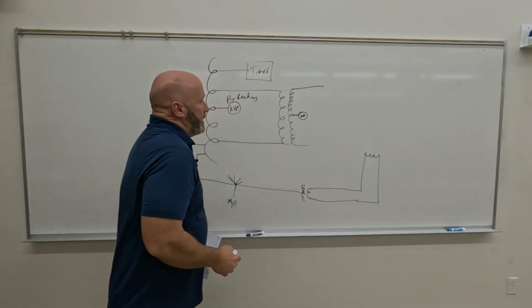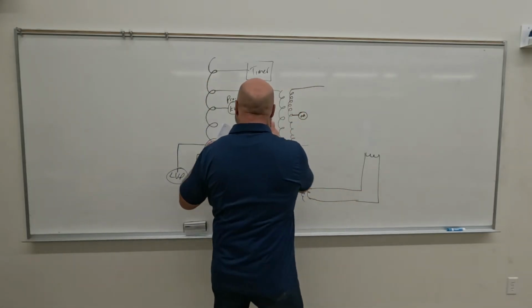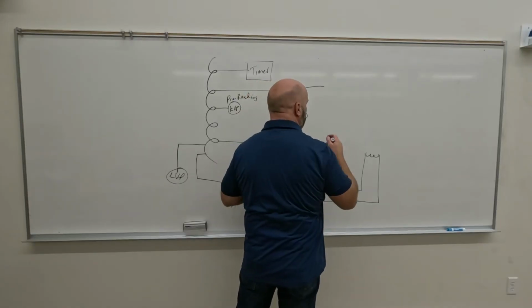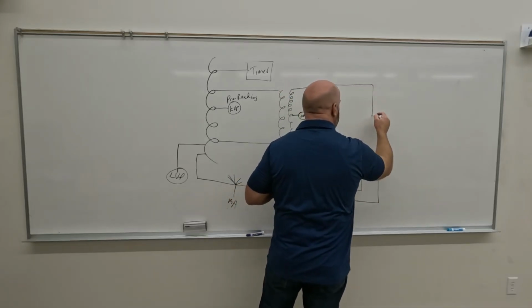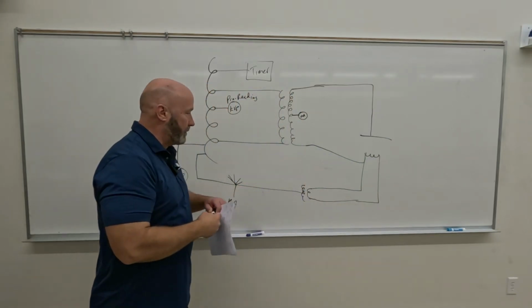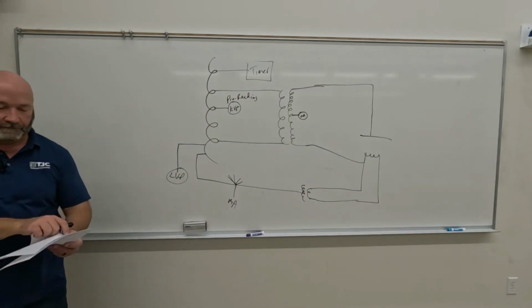So after it comes out of that, we've adjusted our voltage, we've increased it to kilovoltage, and now we're ready to make an exposure, right? So one of those is going to go in that side, one's going to go in this side over here. And so far, what we've got in this diagram is alternating current, right?